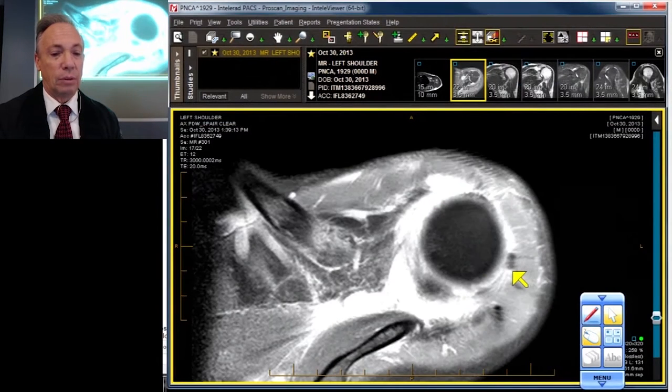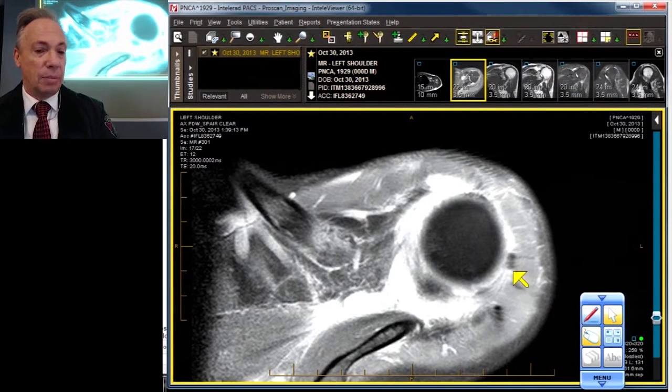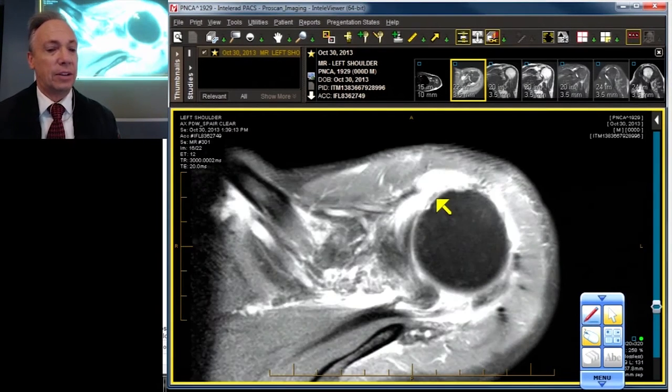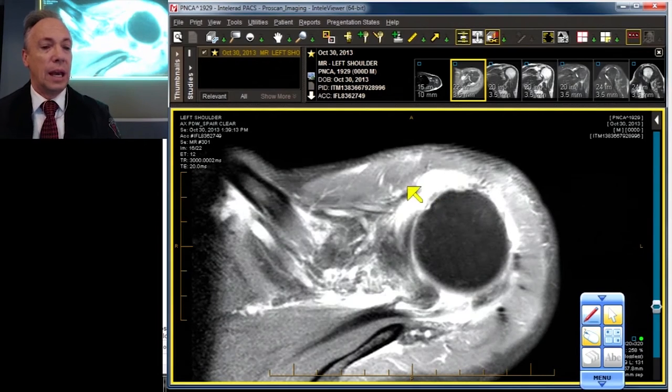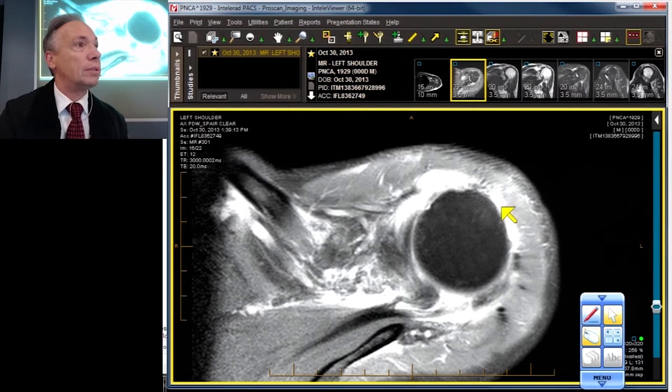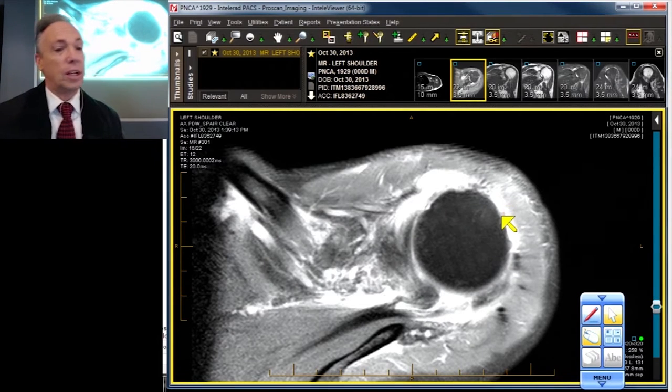Let's work our way down. As we come down we see a large hole, which means the capsule is ruptured. There's lots of fluid leaking out anteriorly, so the capsule is torn. And there is our poor coracohumeral ligament — the retracted edge of it — which should have gone all the way over and inserted on the humeral head. So the coracohumeral ligament and the capsule are torn.